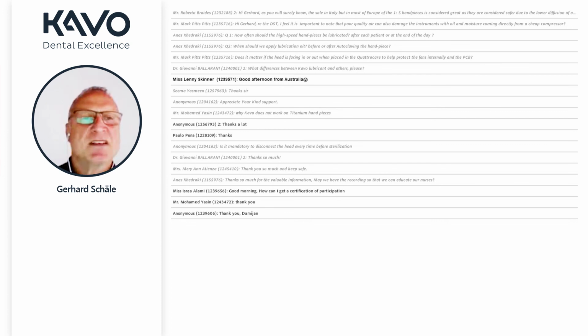So then we have Mr. Mark Pitts. Hi Gerhard, referring to the DST. Yes, that's 100% sure. One important point for the DST when we talk about turbines is the quality of the compressed air. That means the compressor should be of high quality. That means we should not have moisture in the driving air.